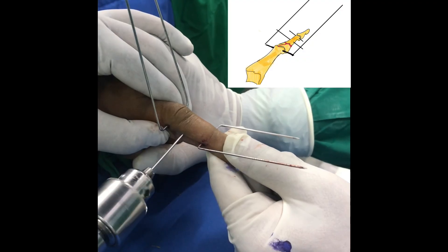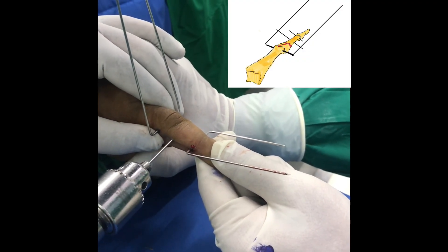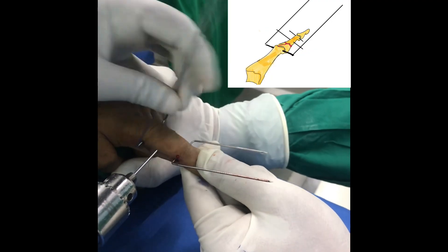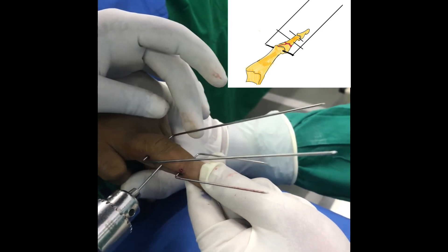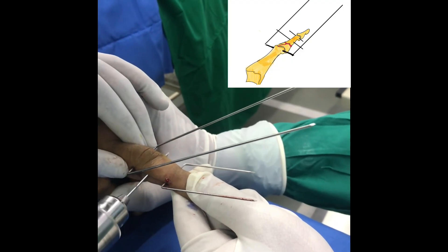This is a blocking wire — this is very important in PIP joint fracture dislocations. This should be dorsal to the mid neutral line. You can see the way the dorsal blocking wire is inserted; it is dorsal to the mid neutral line, and the proximal axial wire should be on the dorsal side of the blocking wire.